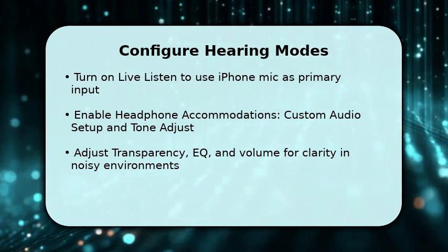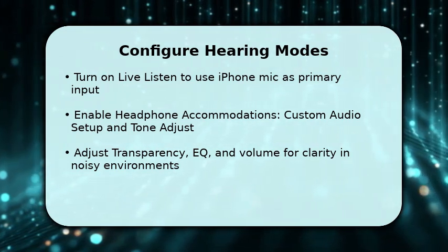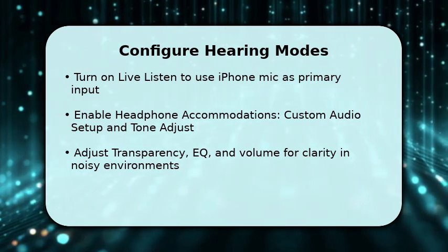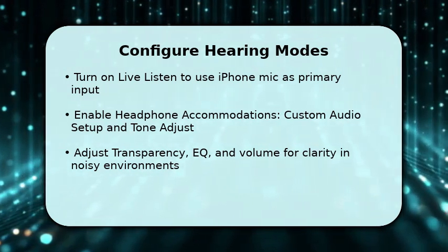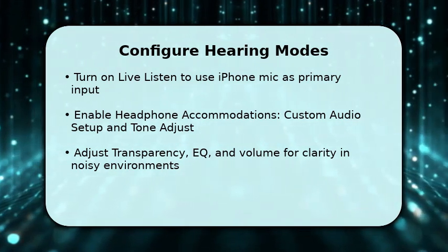Once configured, fine-tune transparency and EQ to emphasize speech frequencies. Make sure to test in a quiet room and then in typical noisy spaces. Keep volume moderate and adjust mic placement on the phone for best pickup of the target speaker.